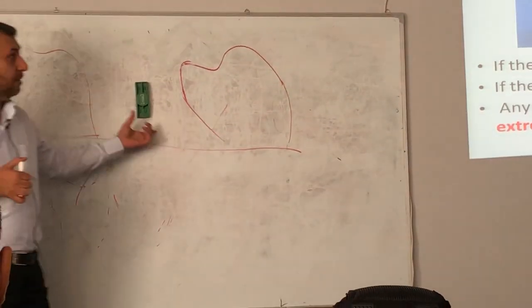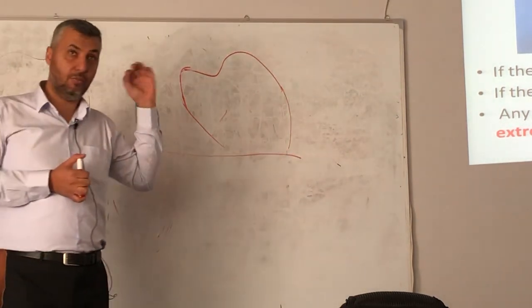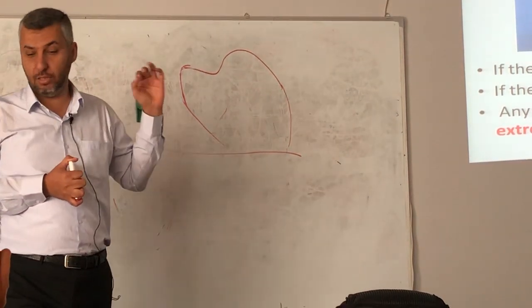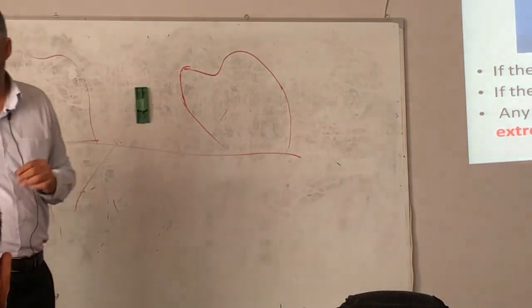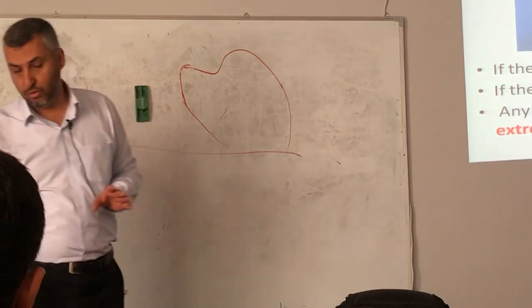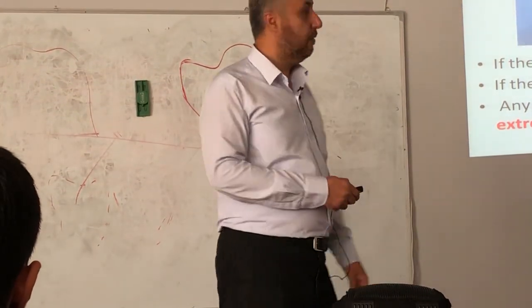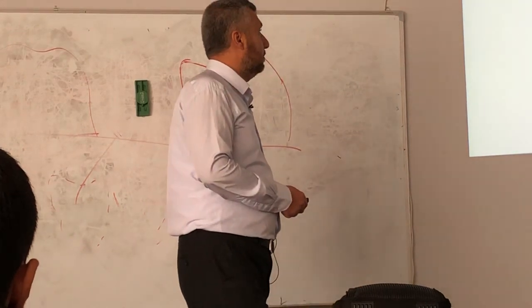These problems are the most common problems that you will face in your dental life. You have two options, either tilting the tooth or grinding of the tooth, enameloplasty.